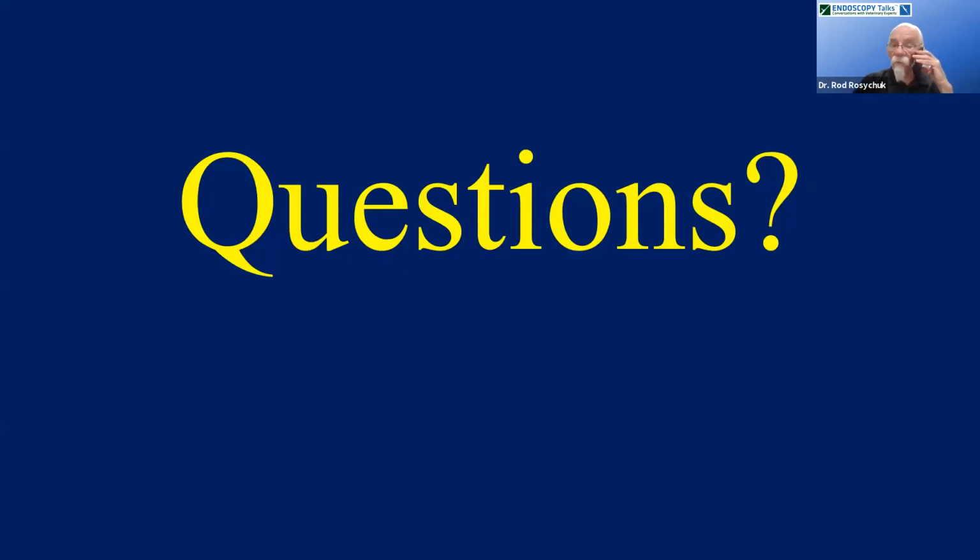It's a good question. You know, the truth of the matter is, it takes time. I think for a very severe ear and just cleaning 2 ears, we're talking an hour 15, 20. Middle ears sometimes take a little longer because I end up flushing. The key to middle ear cleaning is flushing large volumes of fluid through the ear. Very important. And if you have to clean the canals plus the middle ears, just 1 ear can take me an hour.